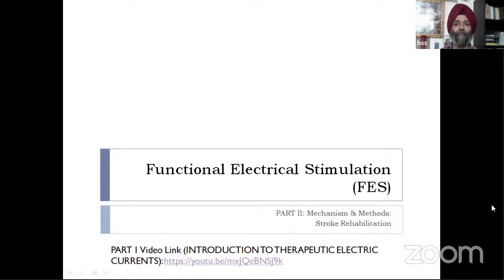in which we had discussed the system of functional electrical stimulation as well as the stimulation parameters, and how the electrical currents interact with the physiological systems of the human body, and especially the nervous system. How electrical stimulation affects not only the peripheral but also the central nervous system. So an electrical current as minimum as millivolts or milliamperes given to the most distal periphery or extremity of the human body can have an effect on the most central aspect of the nervous system, and that is the brain.